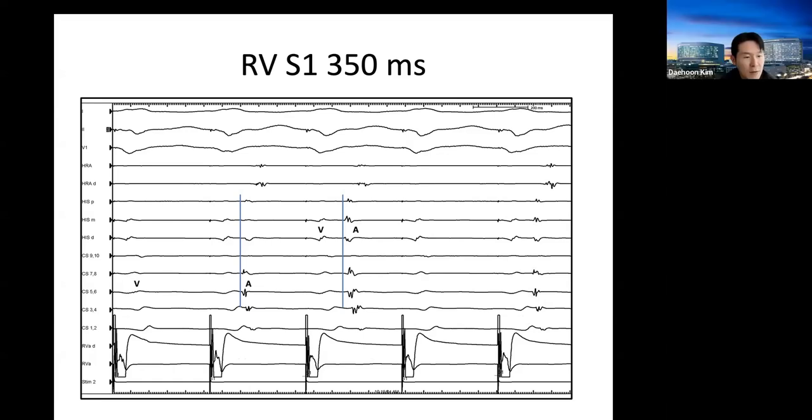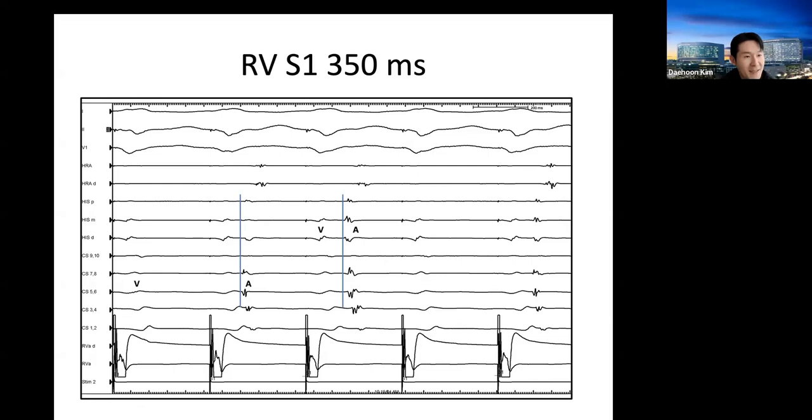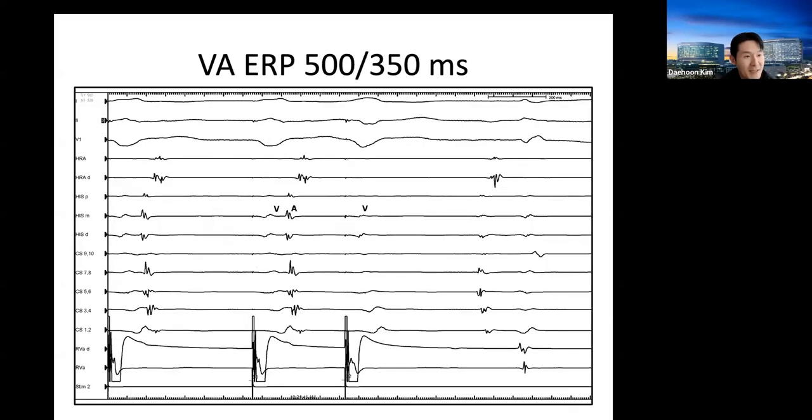some kind of left inferior extension, but I'm not sure. But this is also the VA jump. It's not the first pathway. Yes, I think this is a VA jump. Maybe. Okay, you can go on. Yeah, I apologize.